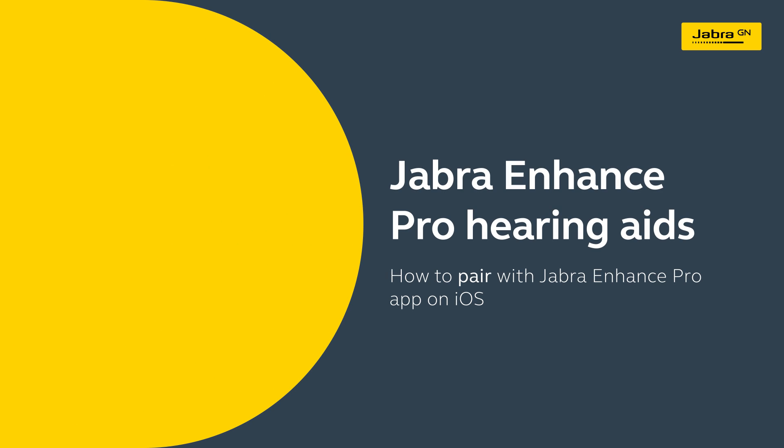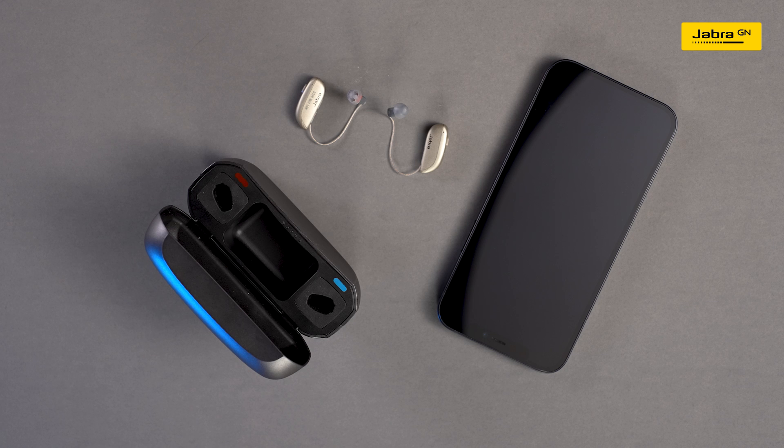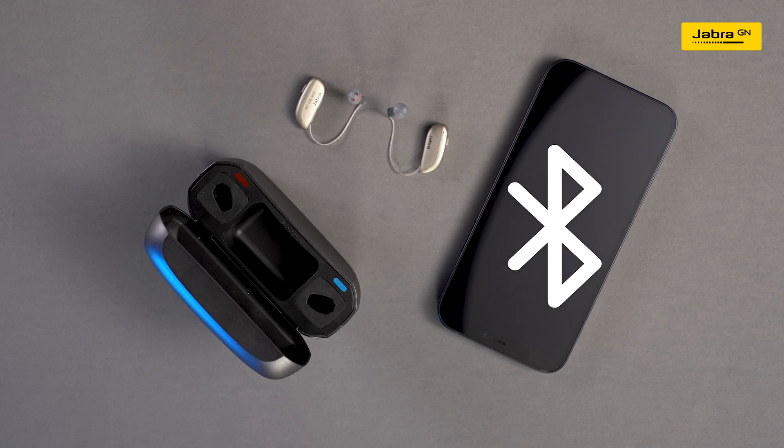How to pair your hearing aids and Jabra Enhance Pro app on iOS. Before beginning, make sure Bluetooth on your iPhone is turned on.